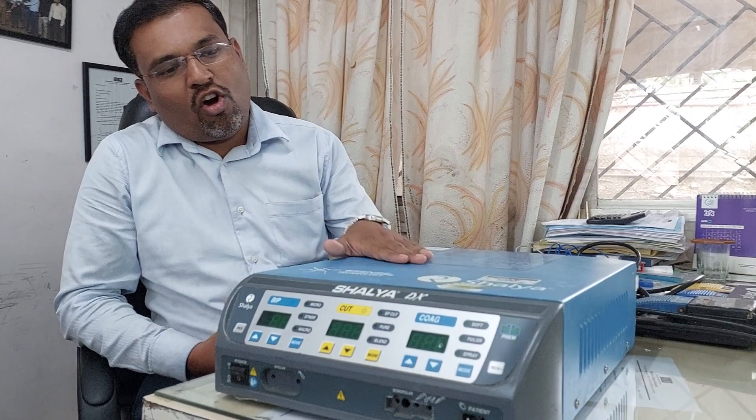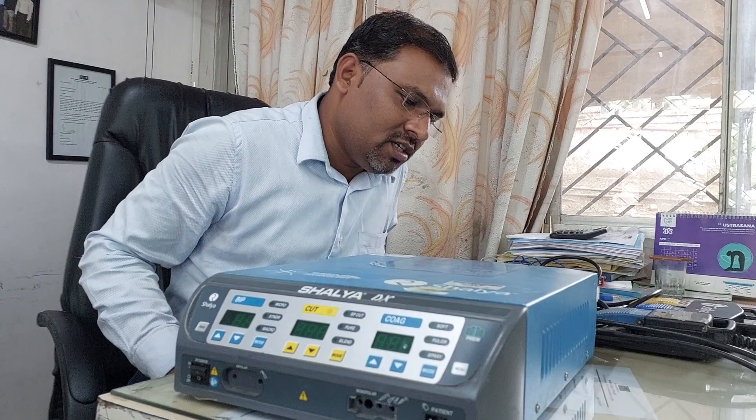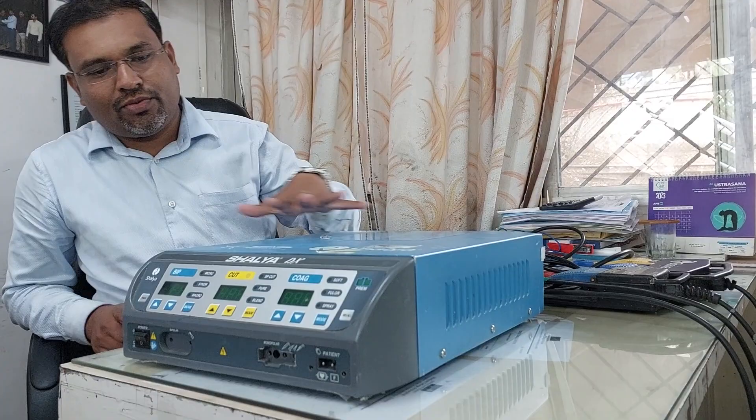Hello guys, today we are going to make a video on the basic operating training regarding the cautery machines. We know that in different types of surgeries in the OT complex, doctors are using cautery machines for cutting and coagulation. I will show you how to make the basic connections of cautery machines.